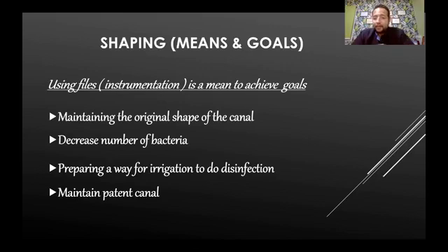In decreasing the number of bacteria, let's say that you extract a tooth with your forceps. Could you put this forceps with blood and tissues in the autoclave and start your sterilization cycle? No, you have to wash it and pack it before you start your sterilization cycle. Why do I wash it? Why?